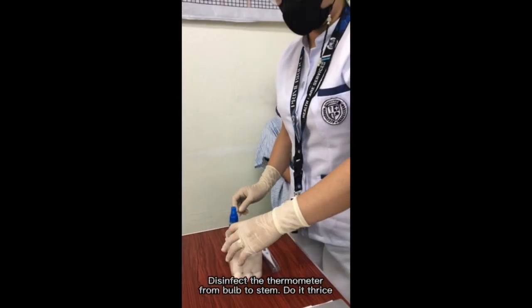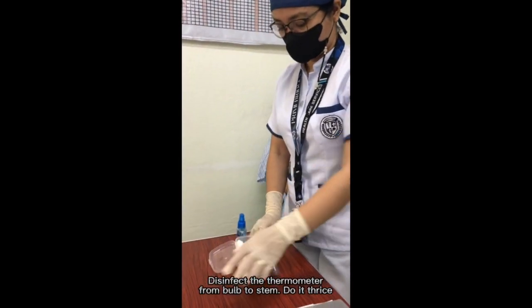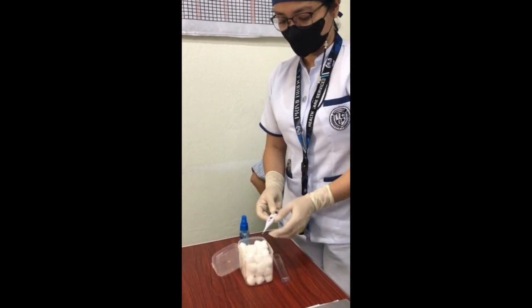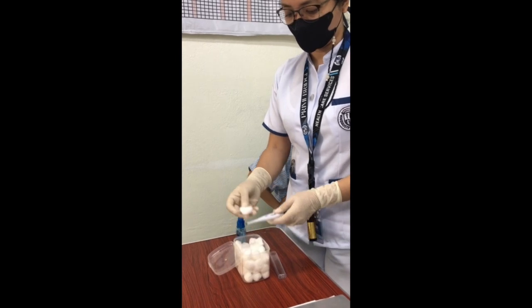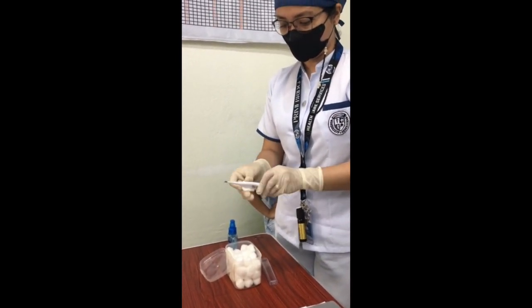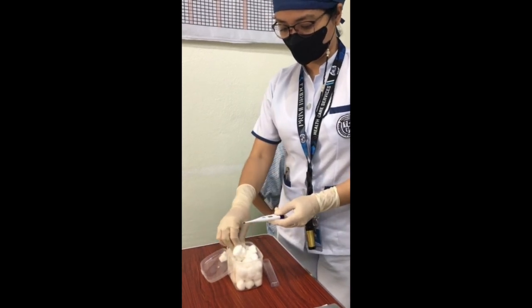The first step is to disinfect the thermometer from bulb to stem — or from the cleanest side, the silver tip of the thermometer, to the dirtiest side, the base of the thermometer where it starts to narrow. Make sure the cotton balls are soaked in alcohol and make sure to do it thrice, as shown in the video.